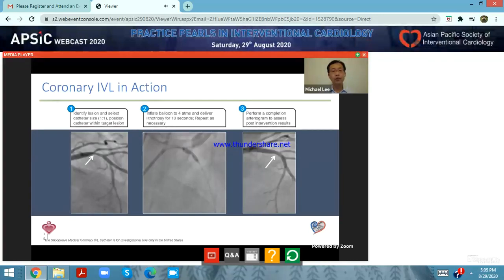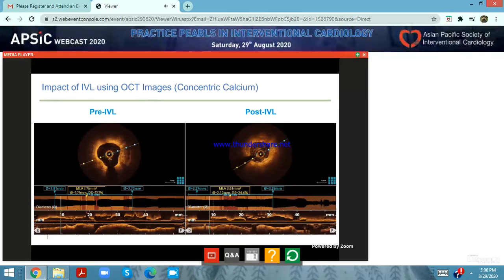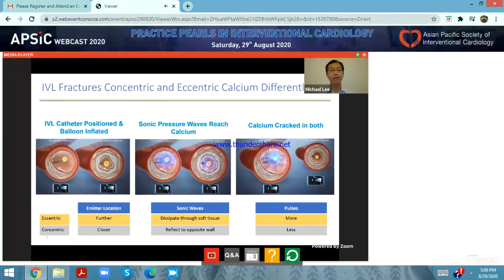How it works is usually you can see it visually when you look at the balloon. The calcium will produce a denting of the balloon, but as you give energy with each pulse, the balloon will get expanded and then you know the calcium has been cracked. If you look at the OCT of the vessel after this IVL shockwave balloon angioplasty, you can easily see a deep fracture of the calcium. You see these fractures, which cannot be achieved by many other atherectomy devices. This will end up in good stent expansion and apposition at the end of the procedure after stenting.